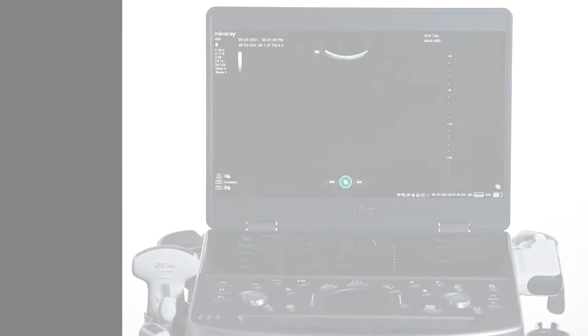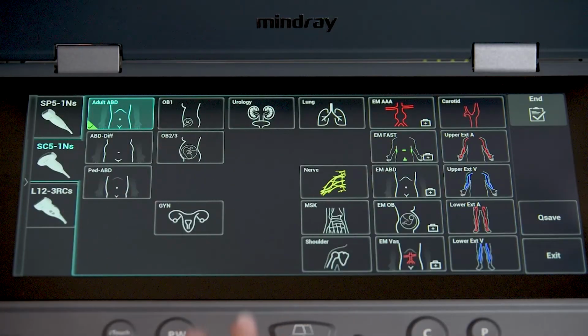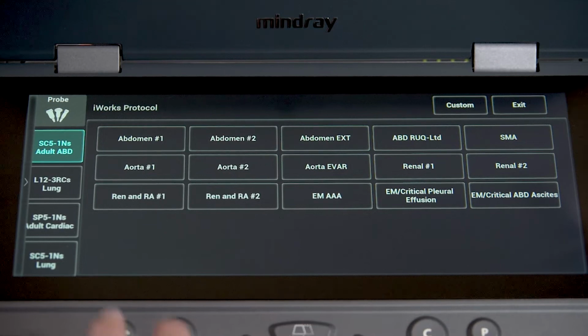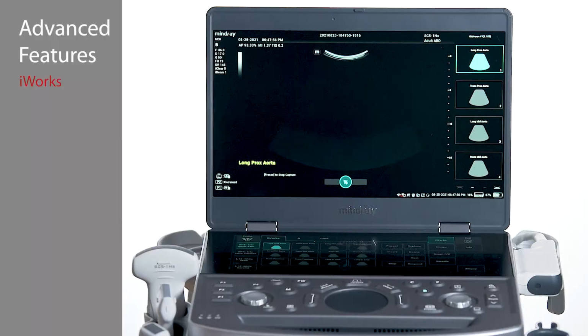The iWorks option is Mindray's protocol feature which allows for guided pre-labeled exams. iWorks is exam mode specific, so first choose the transducer and exam mode. To activate, tap the iWorks tab on the touch panel. A list of iWorks protocols will display to choose from. Tap the applicable protocol from the list.